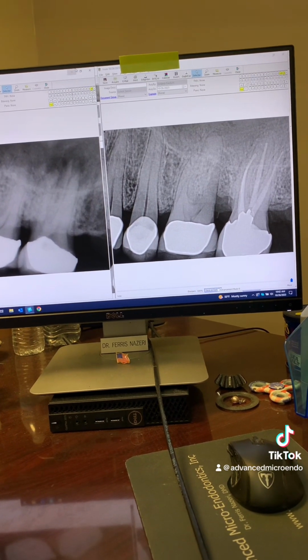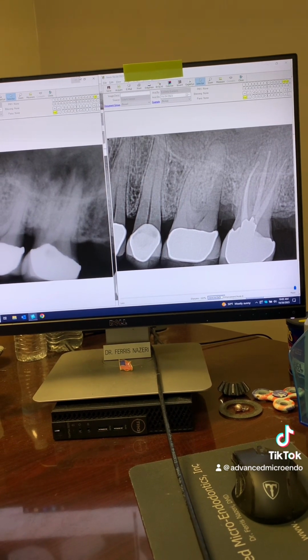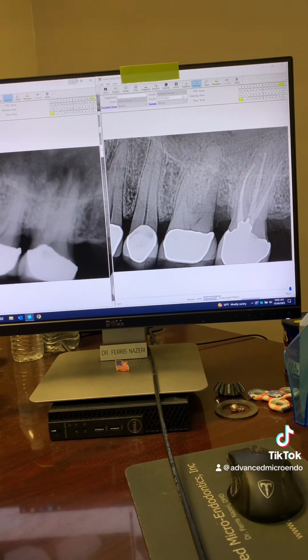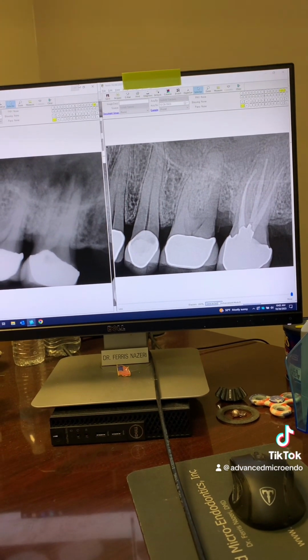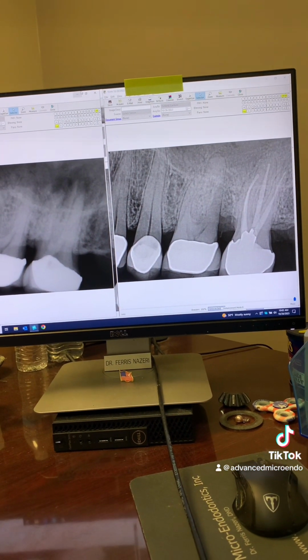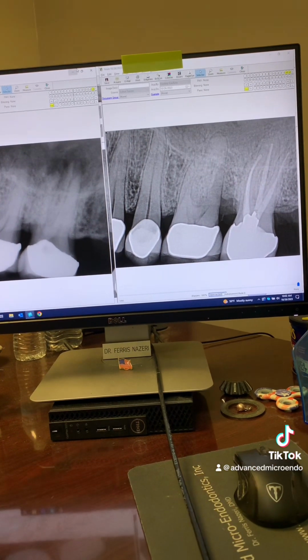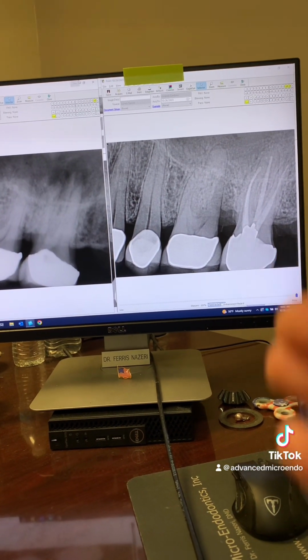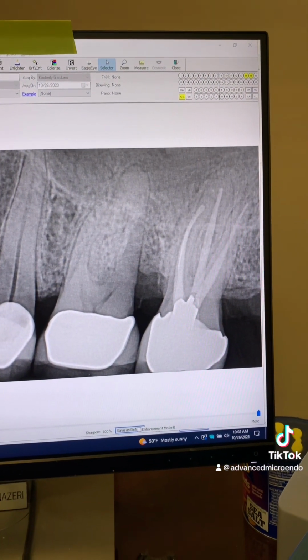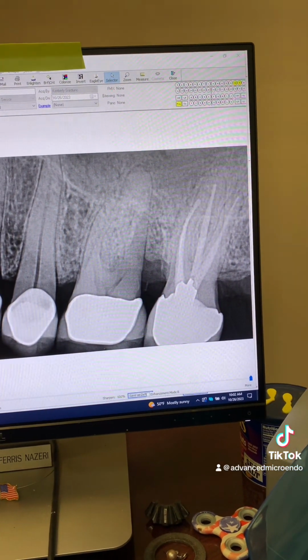But if you put paper points to working length, multiple paper points, same canal, remove them and inspect them, and they're dry, it doesn't matter if there is a periapical radiolucency, doesn't matter if there's a swelling, doesn't matter if there's a sinus tract, fistula, what have you, you can obturate. You can go ahead and obturate. And here is, again, another proof. 10 years, 7 months post-op of tooth number 15.